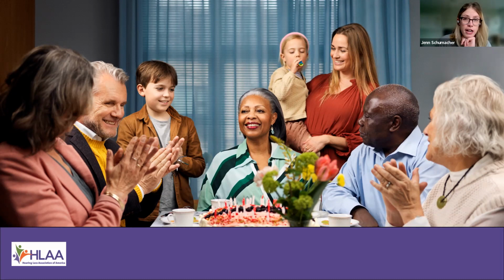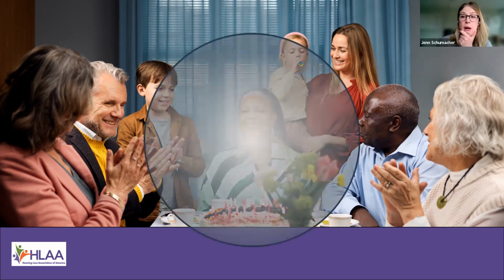So if she's wearing hearing aids in this situation, we could imagine there's a couple of different ways that we could approach this from an amplification perspective. We could put hearing aids on her and make everything around her equally loud. In that case, we don't have to worry about her missing out on anyone talking behind her or to her side. But for anyone who's worn hearing aids in noise, what do hearing aids do? They turn the volume up, right?